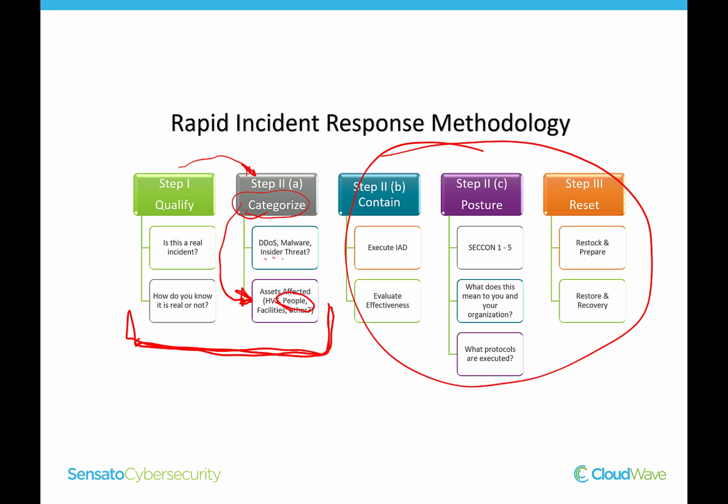But for right now, as part of this chalk talk, really I just want you to internalize this goal, maybe, right? That your teams, your help desk, your clinical engineering, and your SOC, need to know that if you get a call and there's somebody reporting a security incident, the very first thing they need to figure out is, are humans involved? Is there patient safety? Is a patient attached? Is patient care compromised or potentially could be compromised, right?